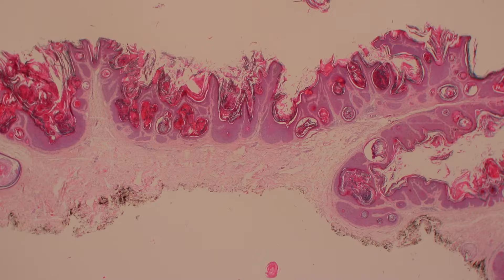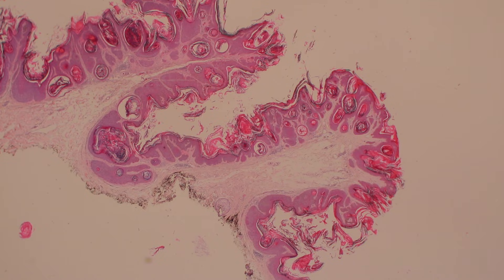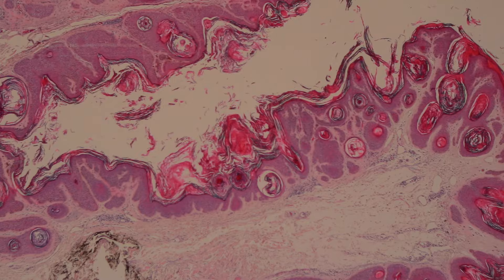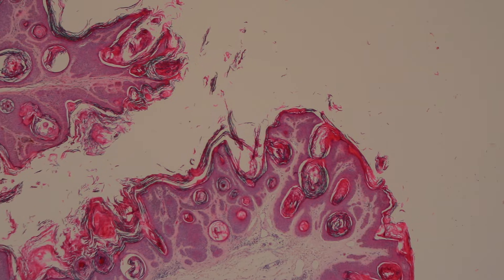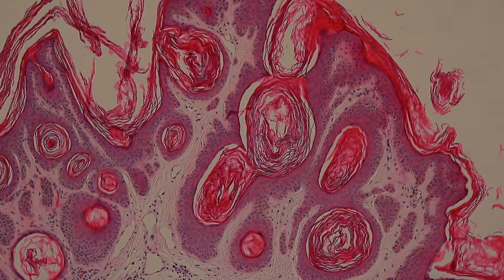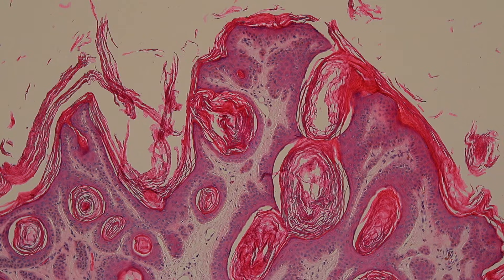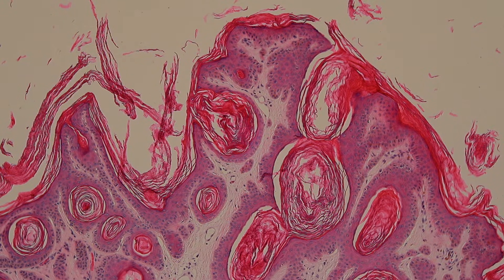Here's another nice seborrheic keratosis — this one has just tons of horn pseudocysts. And again, you can see how nicely, with the right angle of cutting, you can tell that many of them open up to the surface. Look how loose and flaky that keratin is inside of them.